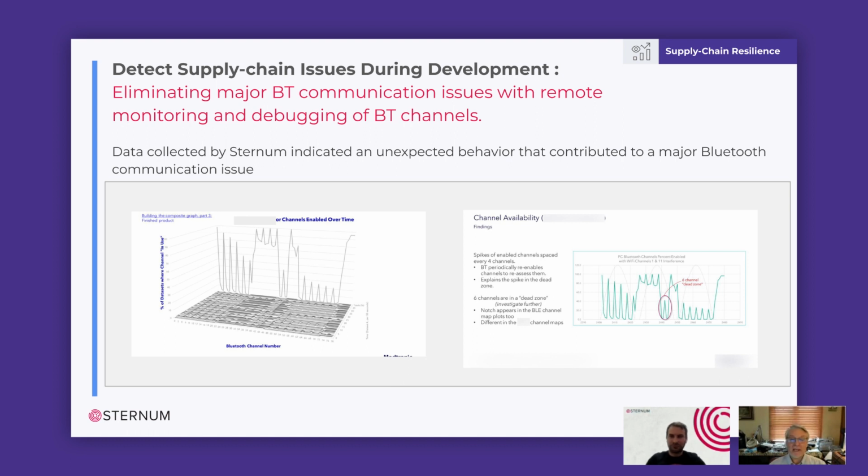And the problem is that in these environments, the noise is changing over time. For example, I would expect that Wi-Fi utilization in a hospital would probably peak around lunchtime because people are taking lunch breaks and surfing the web. And if you're using a Bluetooth system during that time, you would get a different pattern of interference in the Bluetooth channels than, say, at closing time when everybody goes home and nobody's using Wi-Fi. So when you show up to look at this stuff matters.